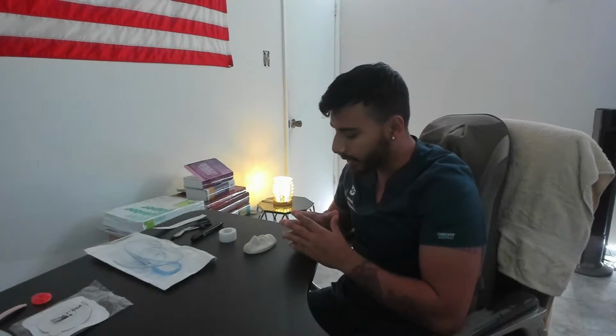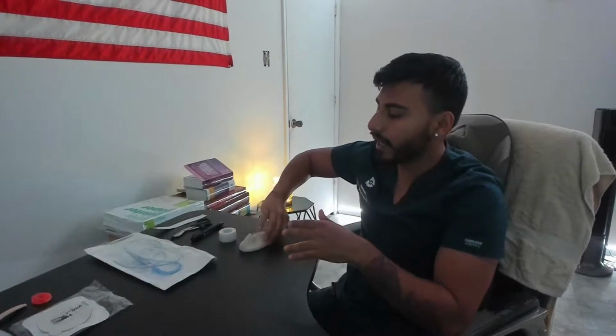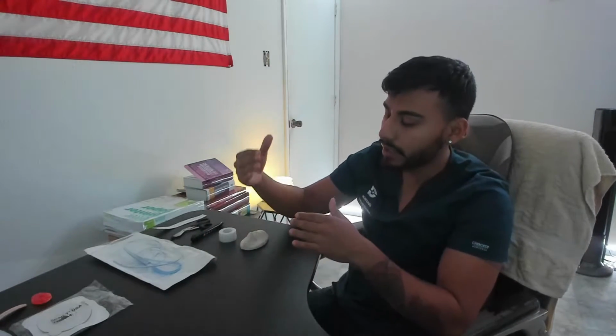Okay, so my name is Eddie, and I'm going to go ahead and start my NG tube insertion. The way I do it is, I first look at my physician's orders and verify that I have the right patient, the name, the date of birth, and the right procedure that I'm doing. So I have Jack Buzzard, 6/20/19XX. I'm doing an NG insertion.